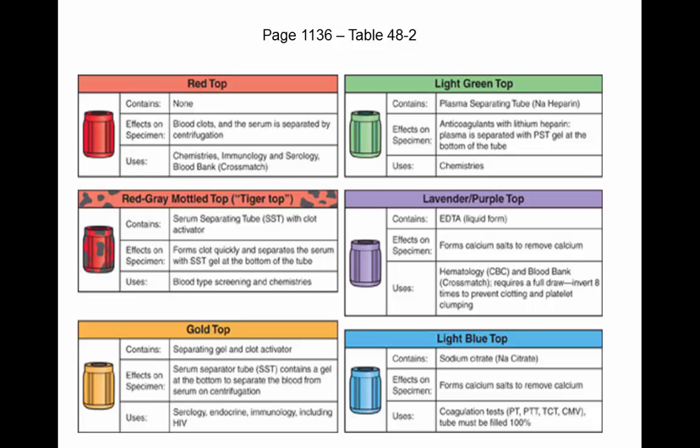So page 1136, table 48.2 in your book describes some of these different tube tops. So be familiar with those. Okay. The red has no anticoagulant in it.